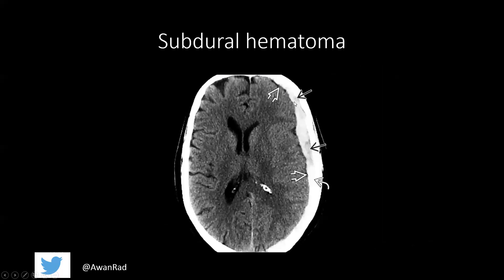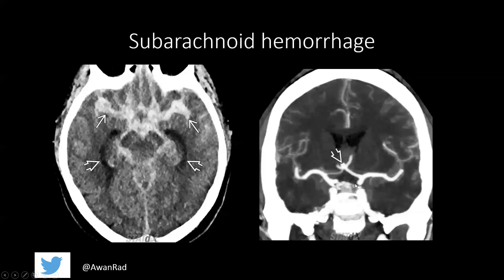In contrast, a subdural hematoma is also seen along the convexity and the periphery of the brain, but notice that it's crescentic shaped with a concave border. This dense material is all subdural hematoma, and it exerts mass effect on the brain parenchyma because it's an extra-axial fluid collection. Subdural hematomas are usually due to tearing of cortical bridging veins.